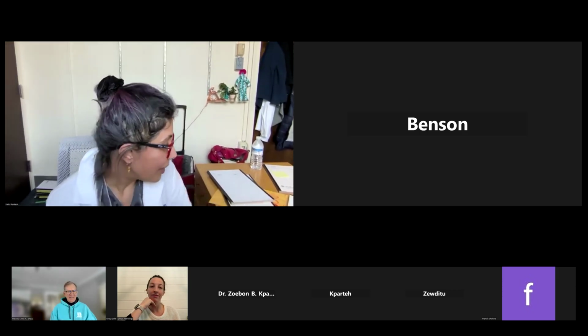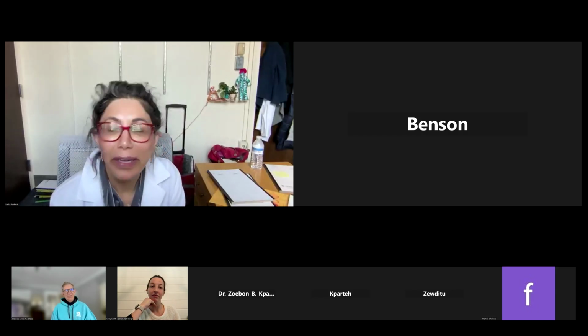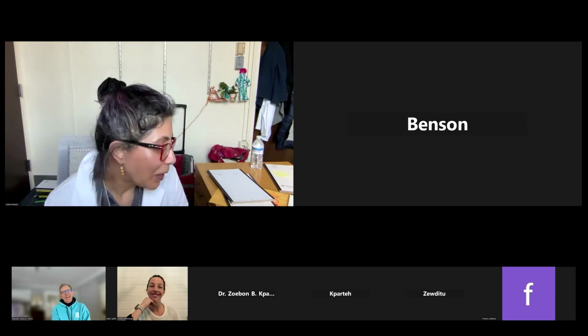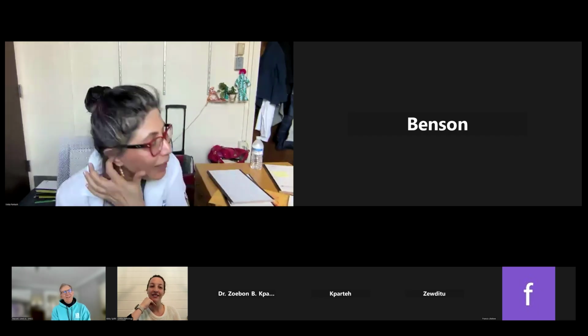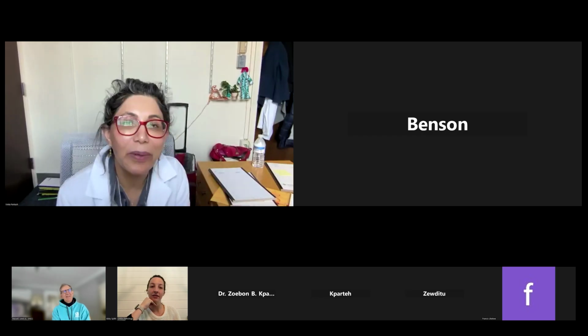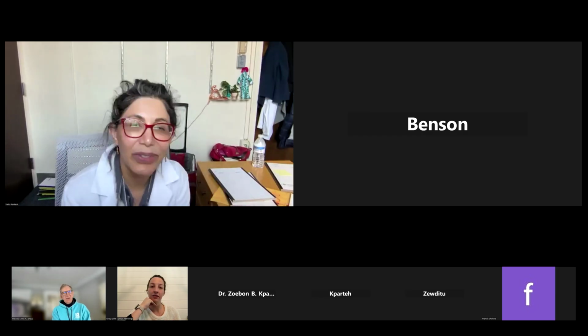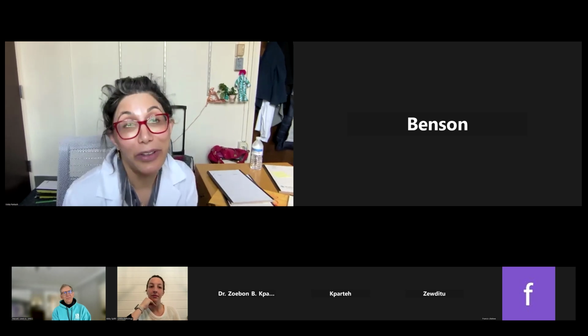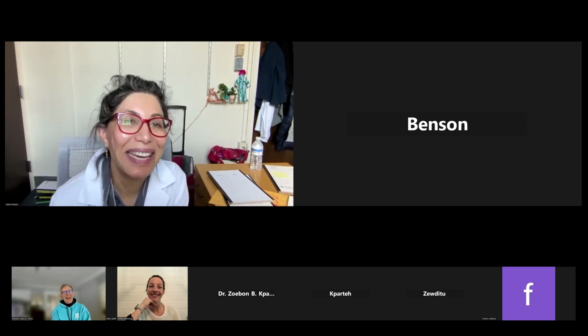And then this one is a follicular lymphoma of the endometrium. Wow. But they're not yet fully completed, so I will probably just post images on these cases.